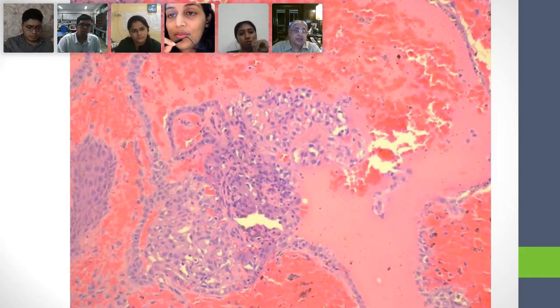So now tell me what the cells look like. Ma'am, these cells look cuboidal, uniform, cuboidal to low columnar, and the nuclei are round. You've finished with the cytoplasm? No, ma'am. Why do you jump immediately to the nucleus?